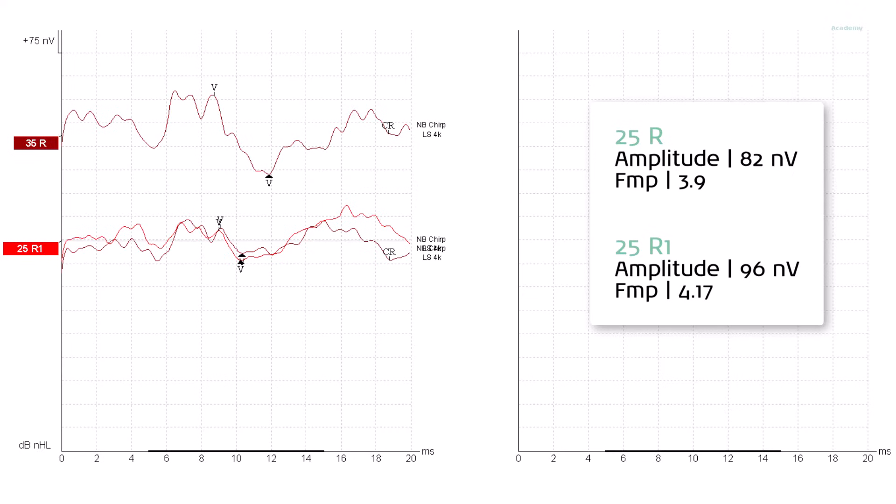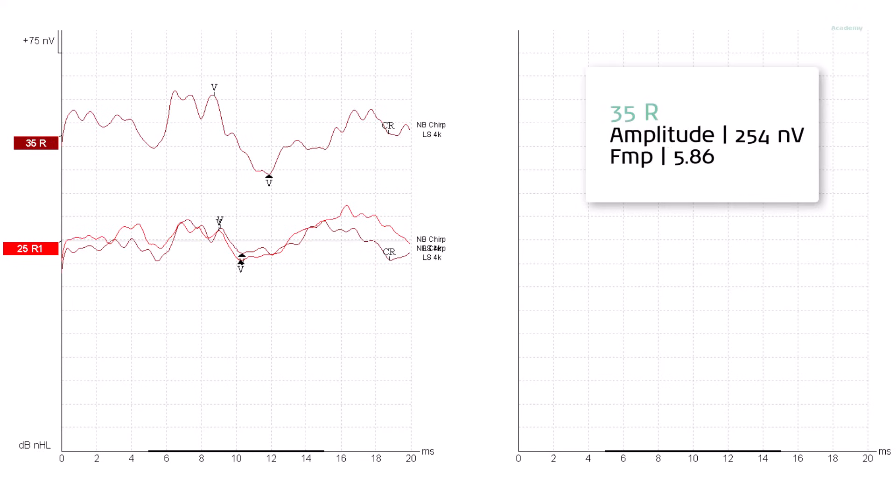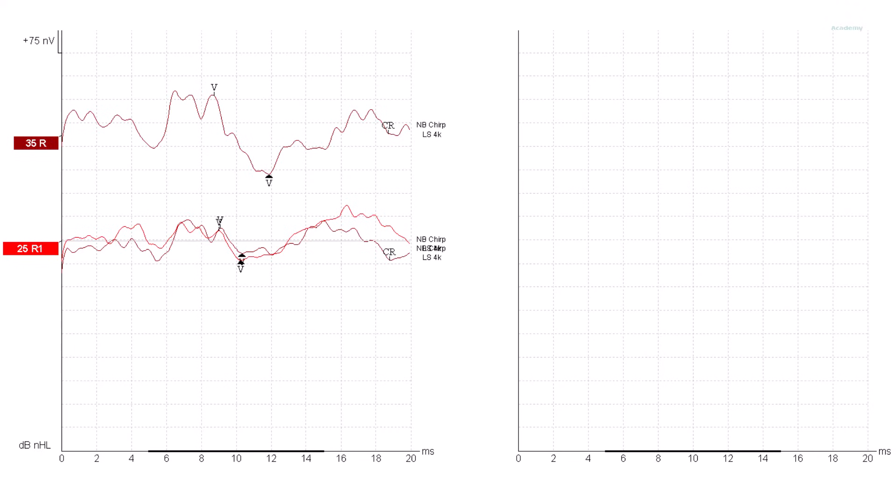The amplitudes are both over 40 nanovolts and the FMP was met as well, adding further confidence to our interpretation. As the first waveform at 35 dB NHL had an FMP value of greater than 2.2 and an amplitude over 100 nanovolts, there is no requirement to repeat this in order to satisfy gold standard. An unreplicated CR waveform is acceptable, but only for the level above threshold. Repetition is still required at threshold. As discharge level has been achieved on the right-hand side, there is no need to test below 25 dB NHL in order to satisfy gold standard. So, on to the left side.